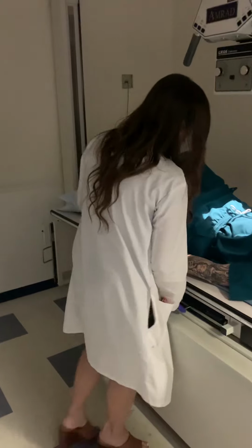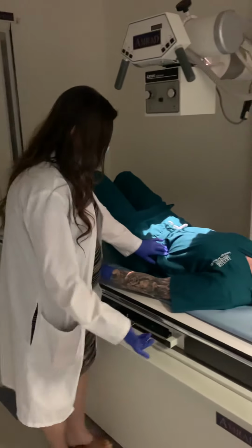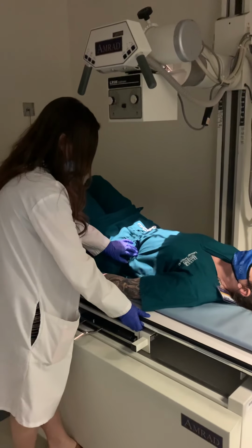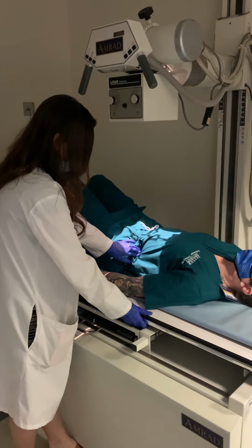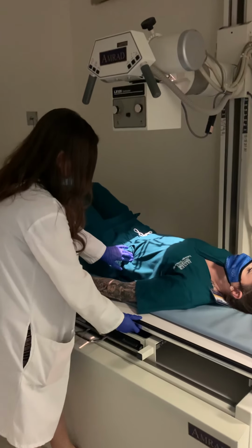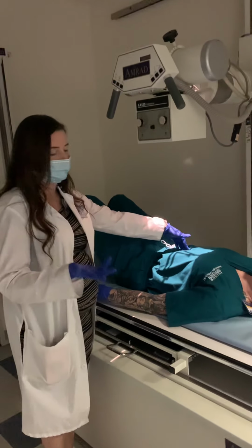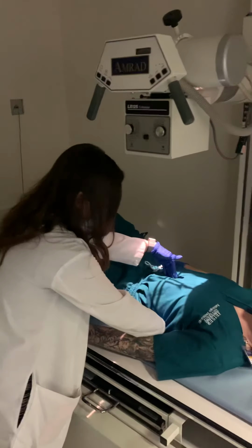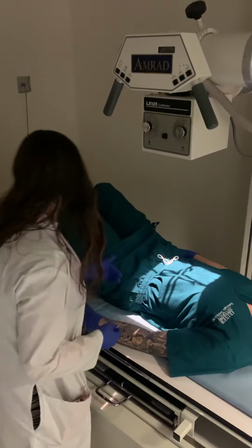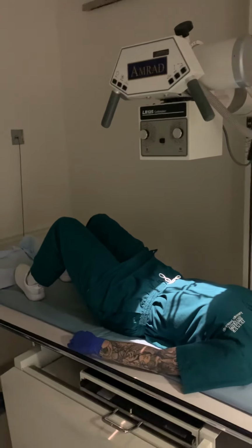All right, so we're in position here. So what am I gonna look for first? L3. So I can feel it pretty easy on her. L2, L3. This is her inferior rib margin if I was squared up here. I'm gonna go up just a little, and I wanna be about midway between this, which is the MSP or the spine, and then the left lateral border of the body. So do you guys want to feel and see if you can actually feel her inferior rib margin? Does that make sense?